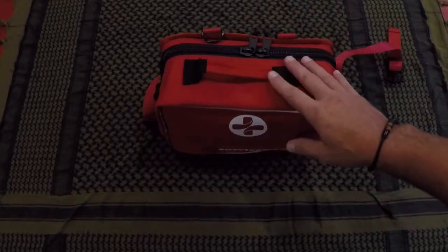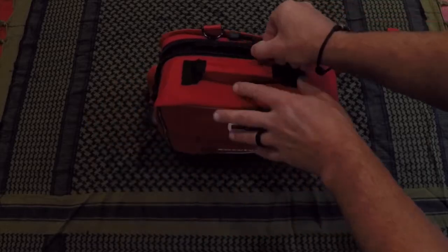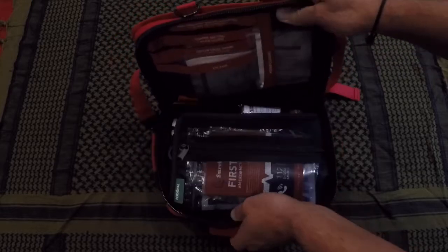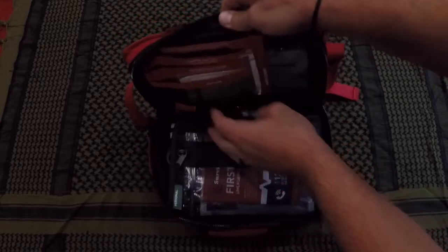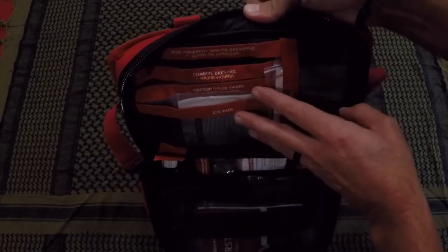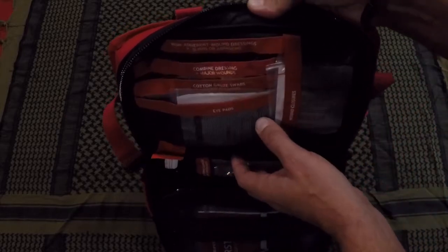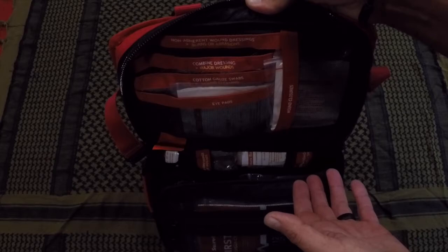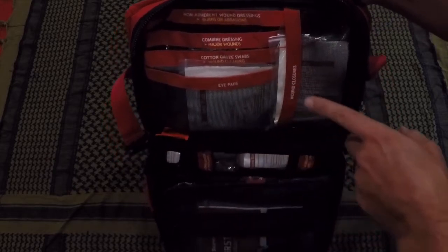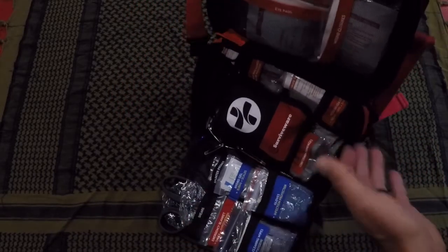One thing that was definitely a huge benefit I found in the first Survivewear kit I reviewed — and this one is set up the same exact way — is how it's labeled on the inside. If something goes awry, especially in an emergency, your heart is beating through your chest, you're nervous, you're sweating, and you're not going to be thinking clearly. Being able to have everything labeled — from major wounds, wound cleaning, wound closures, to shears — just makes everything that much easier.